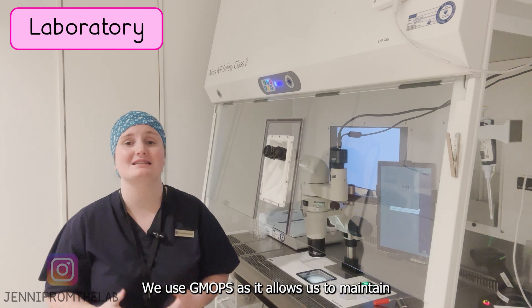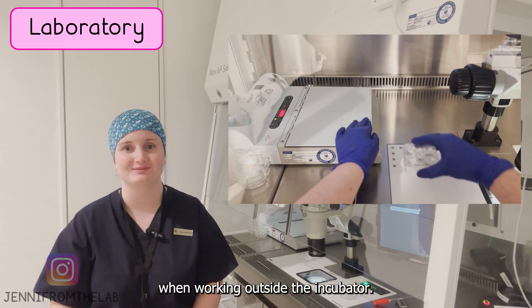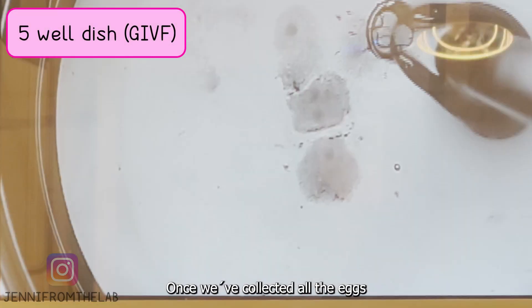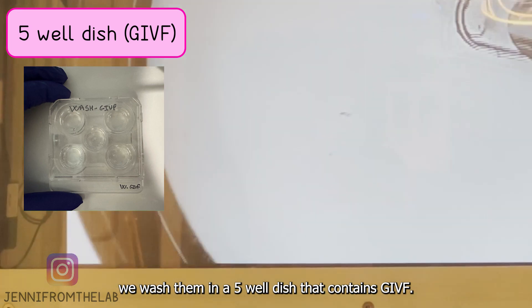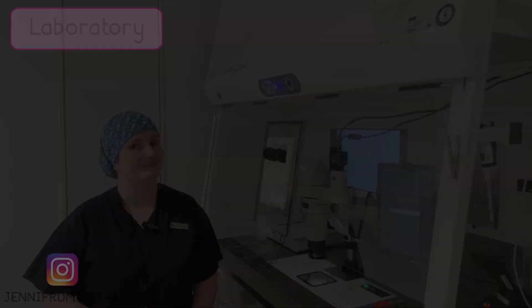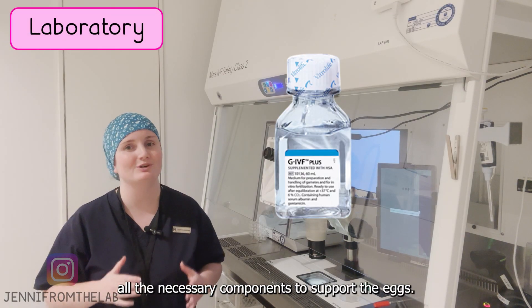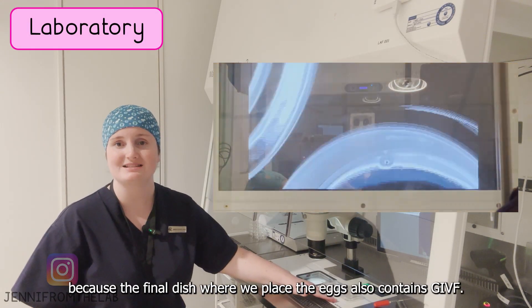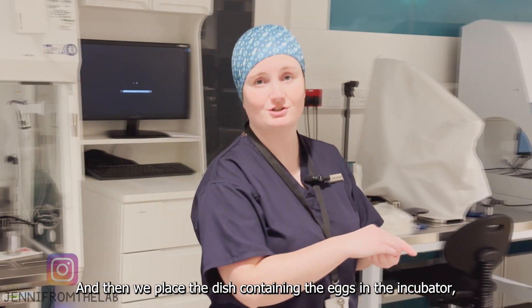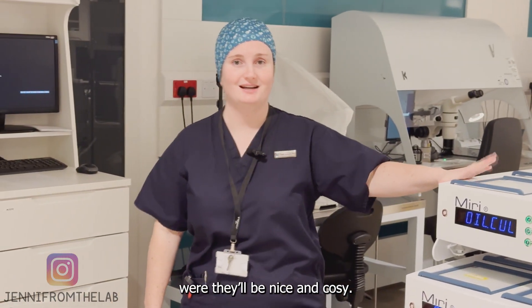We use G-MOPS as it allows us to maintain the correct pH for 10 minutes when working outside of the incubator. Once we've collected all the eggs, we wash them in a 5-well dish that contains G-IVF. G-IVF is a media that contains all the necessary components to support the eggs. We wash them in this media because the final dish where we place the eggs also contains G-IVF, and then we place the dish containing the eggs in the incubator where they'll be nice and cozy.